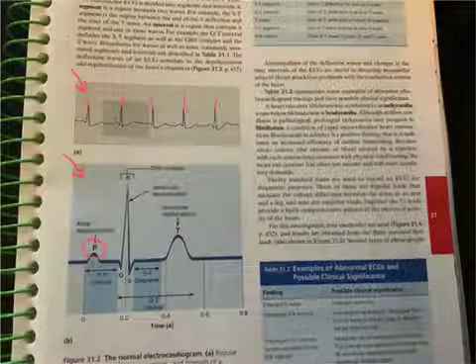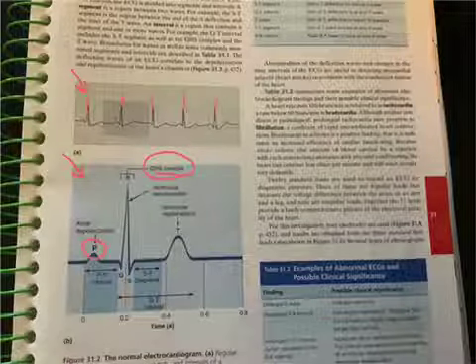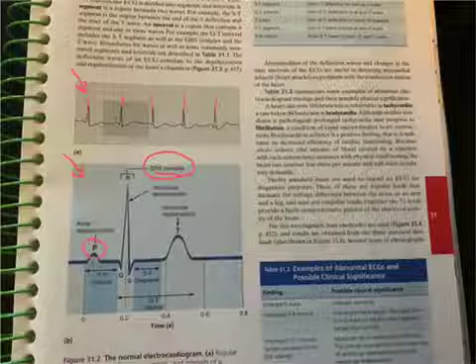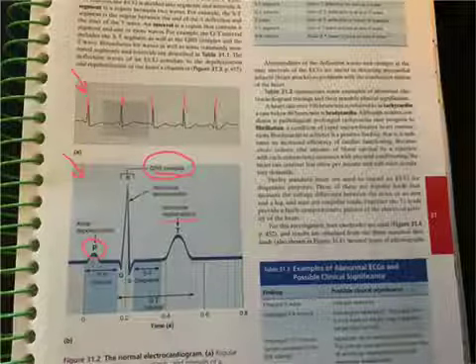And as we learned about heart anatomy, the heart does not have a lot of myocardium in the atrium because its functionality is minimal. Contraction is very minimal in the amount of blood. Remember, most of the blood goes to the ventricle by passive filling. So since there's less myocardium, there will be less electrical activity. When we look at QRS, this is going to have the addition of the ventricular depolarization on top of that atrial repolarization. And then T just looks at the magnitude of ventricular repolarization. R should be very easy to see, very easy to define on any EKG.